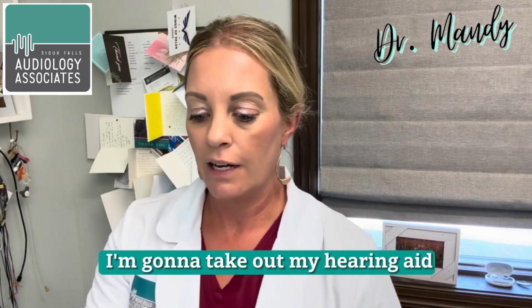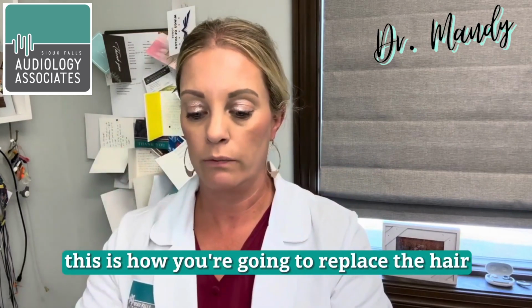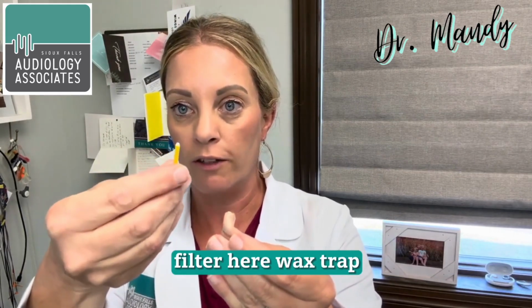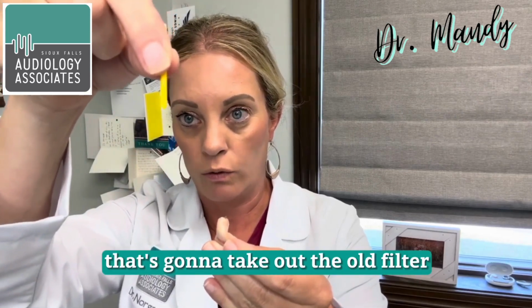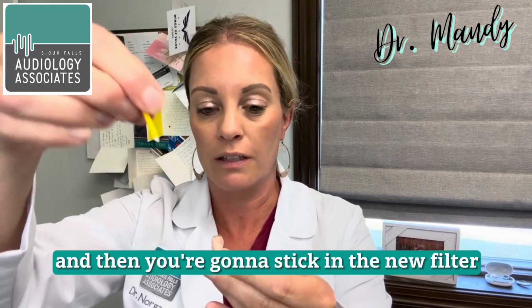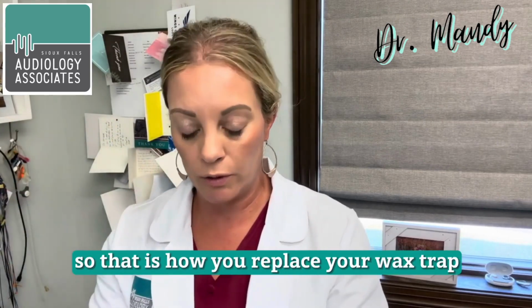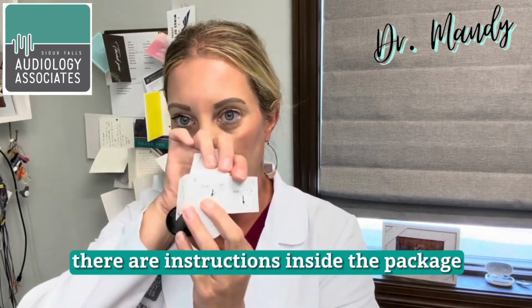And I'm going to take out my hearing aid. So if your wax trap is on a stick, no matter what style you have, this is how you're going to replace the wax trap. We have our new filter, wax trap, here. This end is empty, so this is the end that's going to take out the old filter. What you're going to do is push this in, and it's going to pull out the old filter. There's the old filter. Then you're going to turn this around, stick in the new filter, push it in, pull it out, and it's released. So that is how you replace your wax traps if yours requires a stick. If you have Phonak and Unitron, you're going to have the CeruShield disc. And if you forget how to do it, there are instructions on the inside of the package.